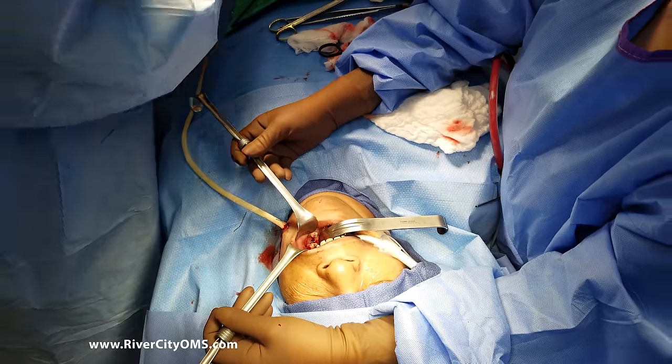Bruce, I need just some 3x3s or 4x4s that can go to recovery, please. Okay. Throat packs out. You want more than 10? No. 10 will do you? Yeah. I need probably 2. Okay. And let's cut.